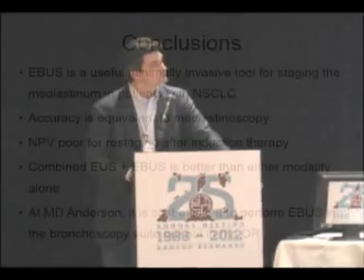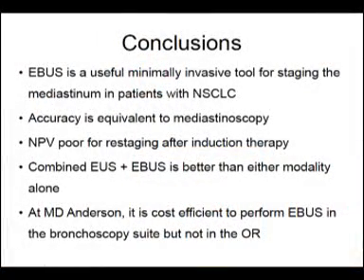So next, please. So in conclusion, I'll finish up by saying that I think EBUS is a very, very useful, minimally invasive tool for staging the mediastinum. Next. I think it is going to be shown to be as accurate as mediastinoscopy, and I think for routine mediastinal staging, it is going to change what we do.